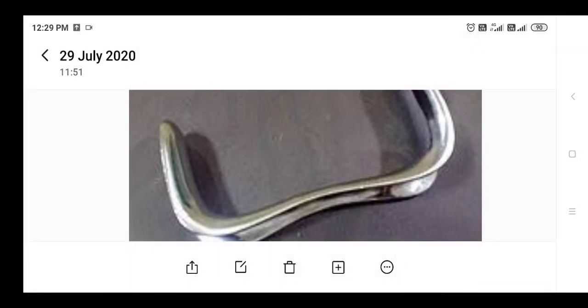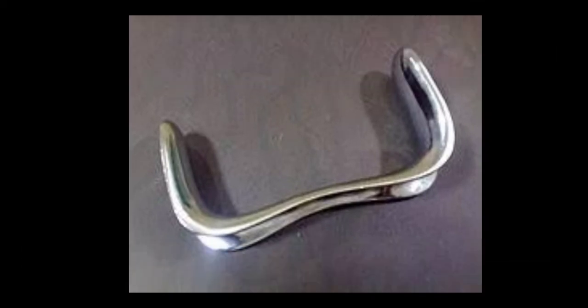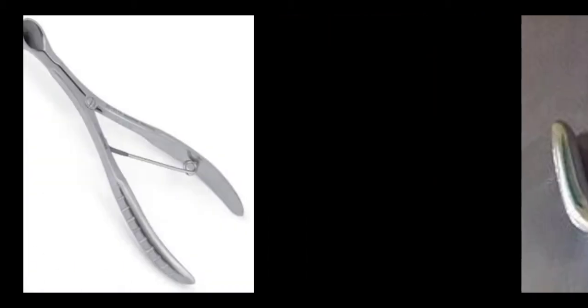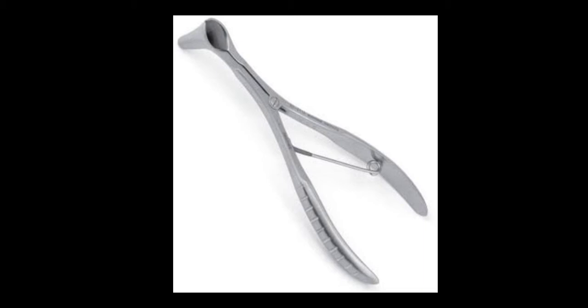This is a Sims speculum — Sims vaginal speculum. It is an instrument used to examine the vagina of a female patient. See carefully, because all these instruments can be asked in any form of examination.